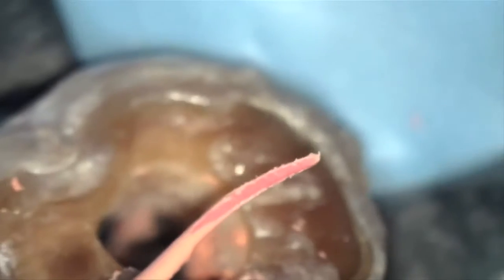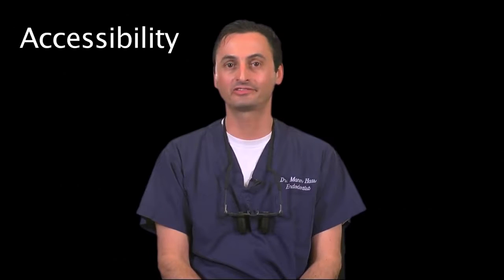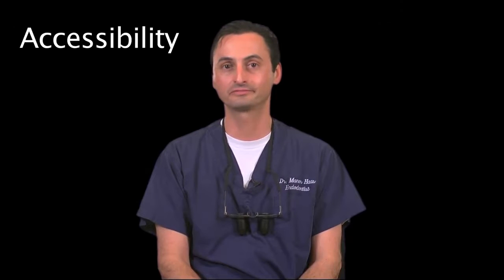If or once the sealer is fully set, you may retreat the GuttaCore the same way you would any other gutta-percha-based obturations. Now I'd like to discuss accessibility into difficult to reach sites.